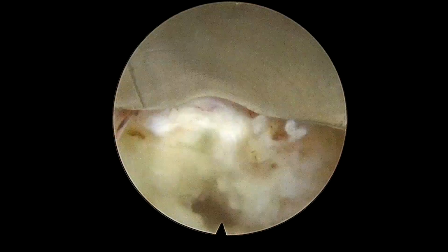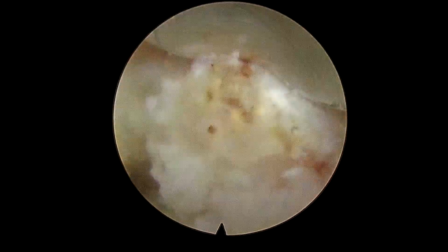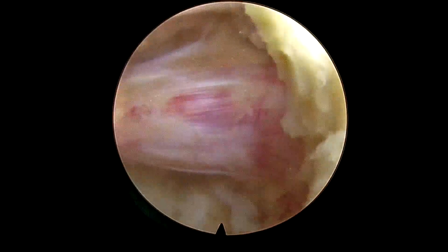This is midline. This is some remaining part of the annulus.